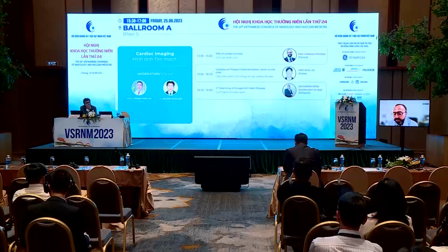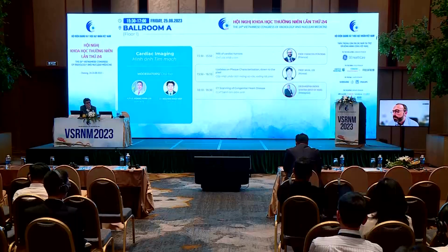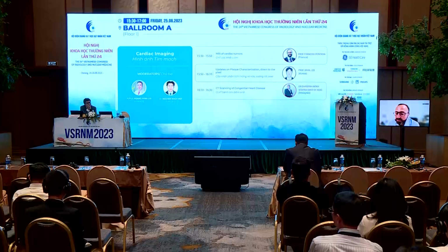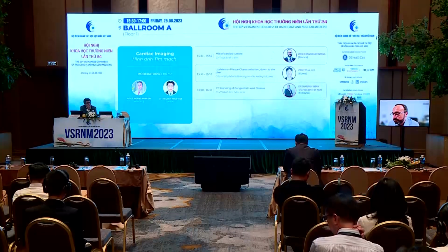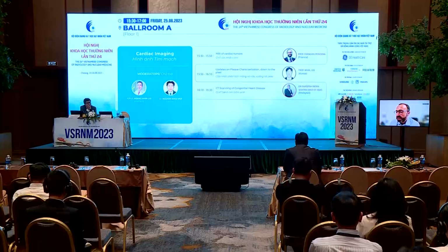Most of the time, the normal T2 value is 45 plus or minus 5 milliseconds. And regarding T1, there is a wider variability. For instance, in our center, the normal value of T1 is between 950 and 1050. But it's very important to do this calibration.